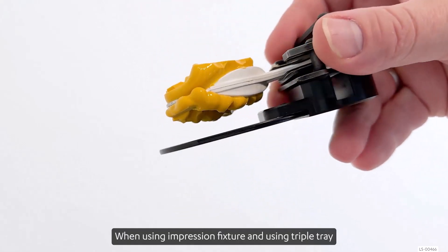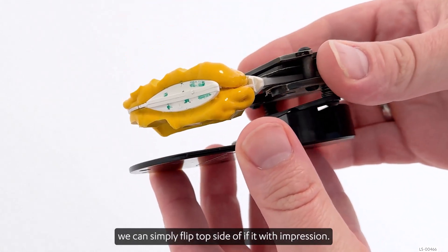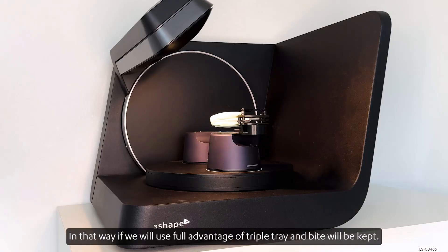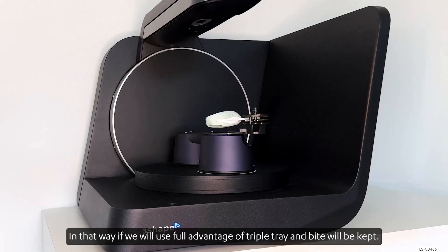When using the impression fixture with a triple tray, we can simply flip the top side of it with the impression. In that way, we will take full advantage of the triple tray and the bite will be kept.